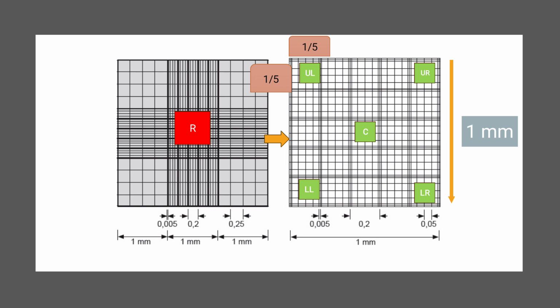Okay, we can identify the upper right and upper left. How can you identify? In the upper left, there will be no boxes above and to the left. In the upper right, there will be parallel lines and no boxes above and to the right. In the lower left, there will be no boxes to the left and below. And in the lower right, there will be no boxes; the parallel lines will be in the lower part and to the right.